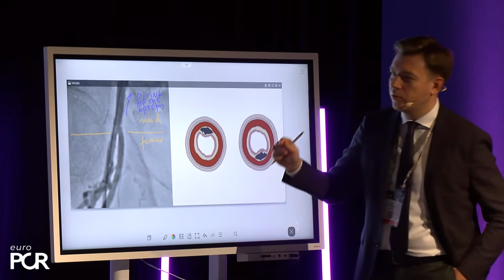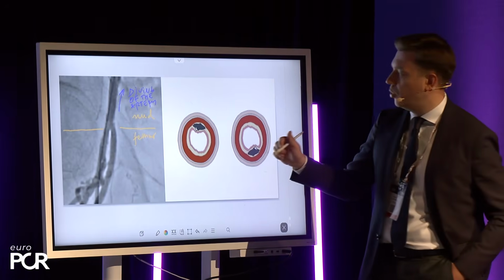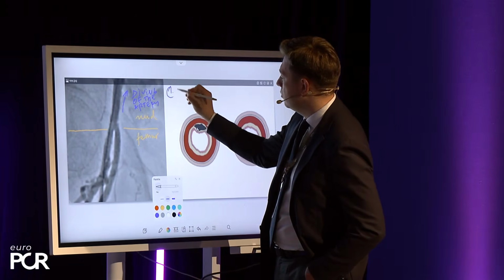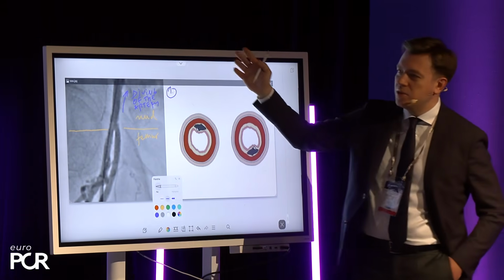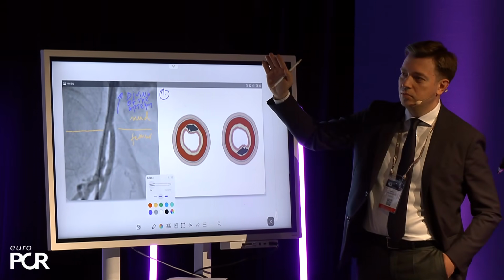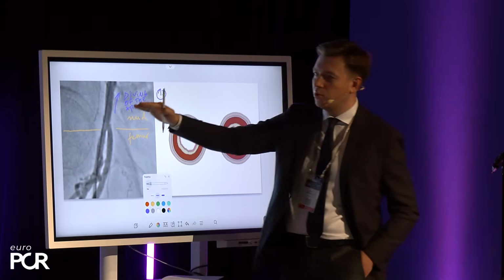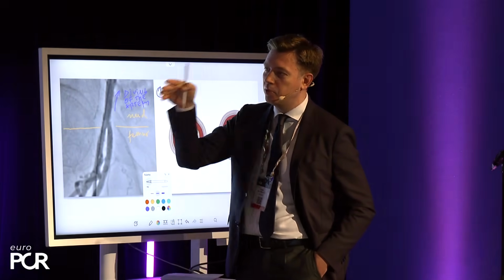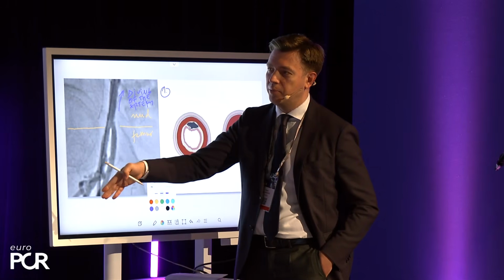So you said it's important for 2 reasons, and you said 2 points. One point was the diving of the artery. Can you see that actually on angio? If you do the angio guidance, this is going to be above, it's not going to be seen, yeah? Why is it problematic that we put our ProGlide or ProStyle in that part of the artery?